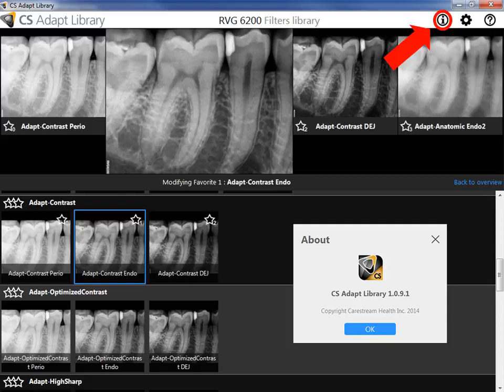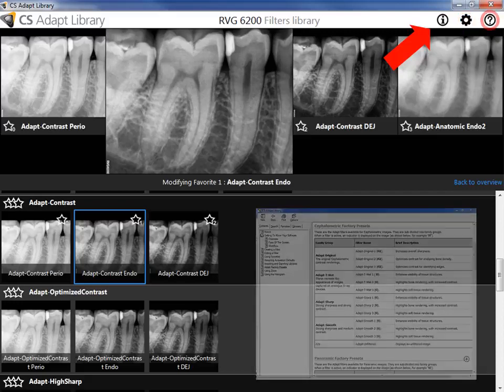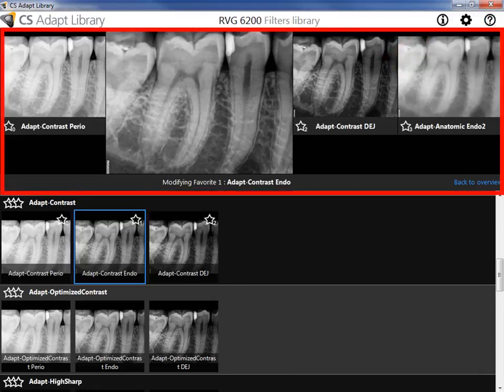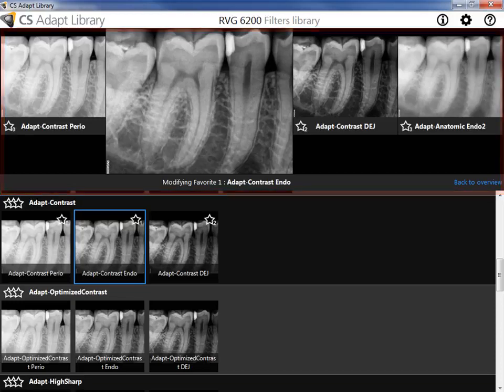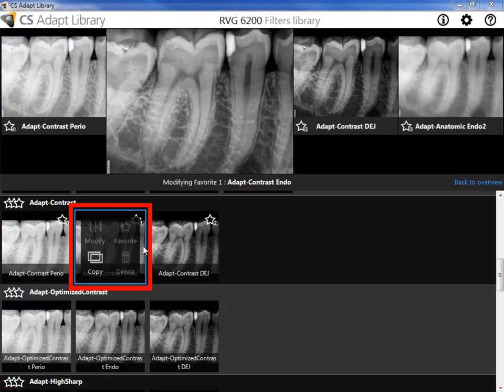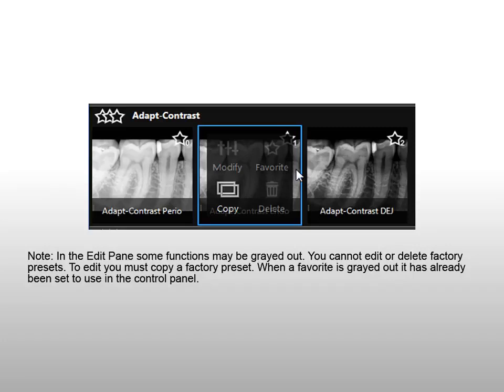About displays the application about information. Edit Preferences imports or exports libraries of favorites and custom filters. Online Help opens Online Help. Overview shows the effect of a selected filter; the filter is highlighted in the gallery. Gallery displays thumbnails of available filters. Place your mouse over a thumbnail to display the Edit Pane functions. Note: in the Edit Pane, some functions may be grayed out — you cannot edit or delete factory presets.